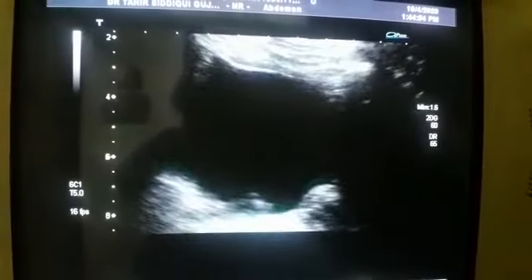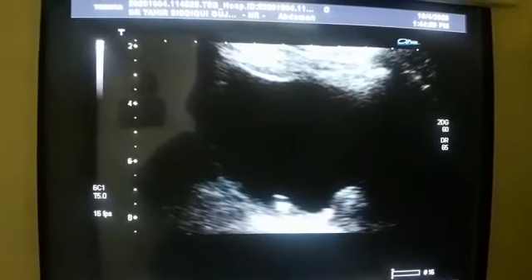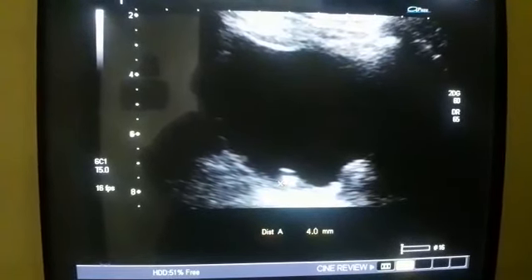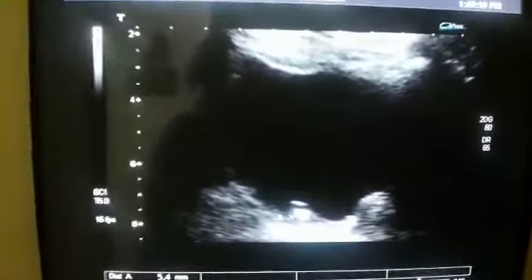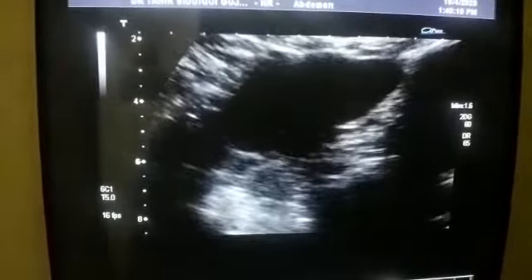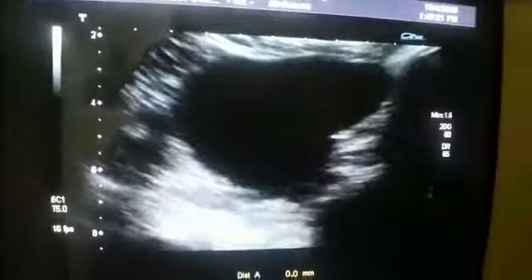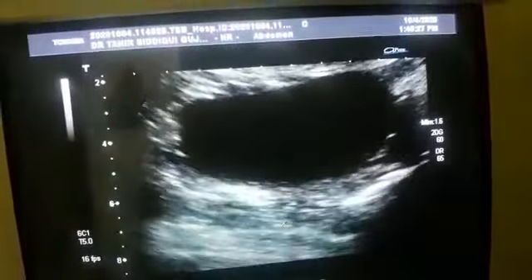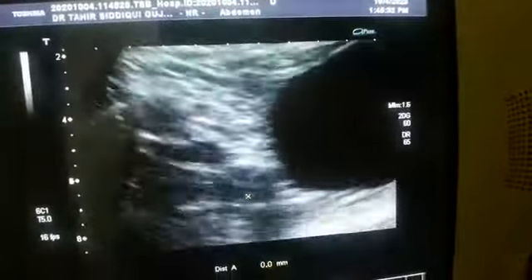This is the urinary bladder, and this is the calculus within the right ureterovesical junction. And if we concentrate, it opens into a tube-like structure. Here, this tube-like structure, another tubular structure, at the tip of which.